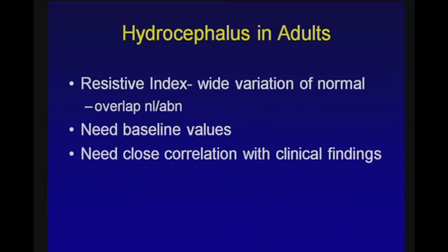Some studies have looked at hydrocephalus in adults. Unfortunately, there is a wider variation of normal, and it's more useful if baseline values are available, which typically are not. And you do need to have closer correlation with clinical findings.